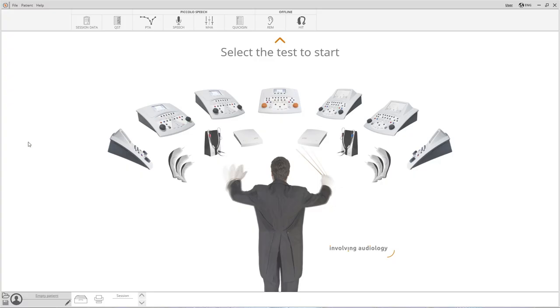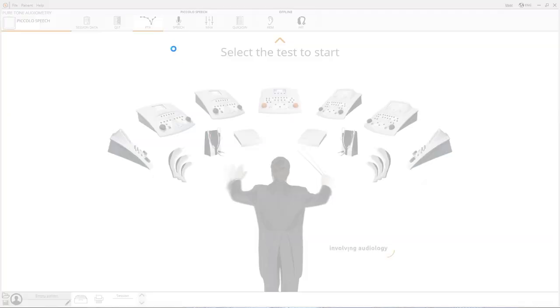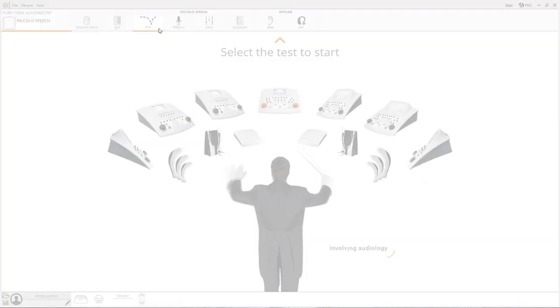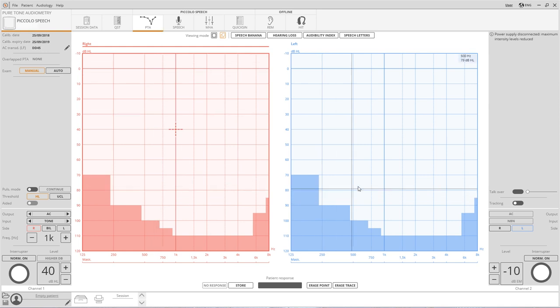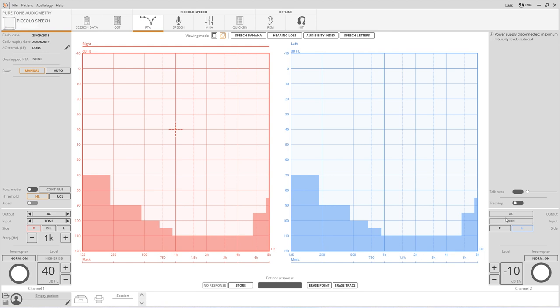Exams available will be shown on the upper part of the screen. Select PTA to start a pure tone audiometry test. The screen Maestro displays when pure tone audiometry is selected maximizes the dimensions of the audiograms in the center and arranges the control buttons into two columns at the side of the screen.